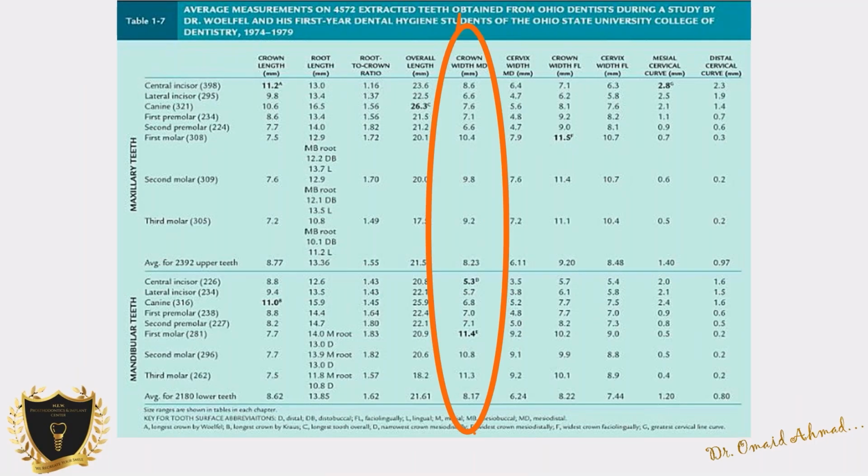The easiest example today in the digital world: I use a contralateral tooth. If a person is missing 19, I look at number 30. If it's a virgin tooth, I can just duplicate or clone it on the other side and get the results. I can do these measurements digitally on a scan, or clinically with a probe, and then digitally on radiographic data from cone beam CT. So this is also one of the charts I would recommend. If you don't have it, you can Google it, or if you have a book, you will be able to access this.